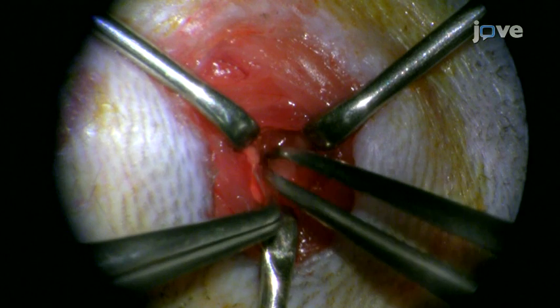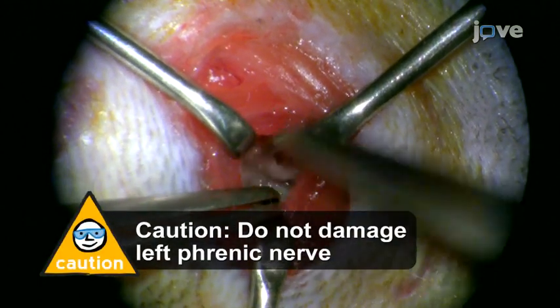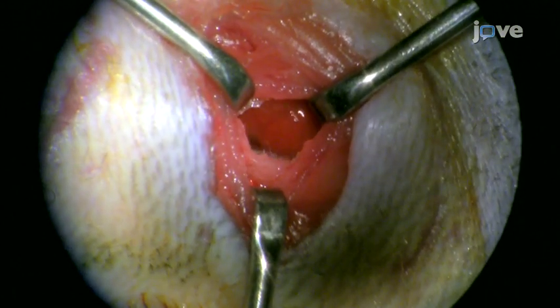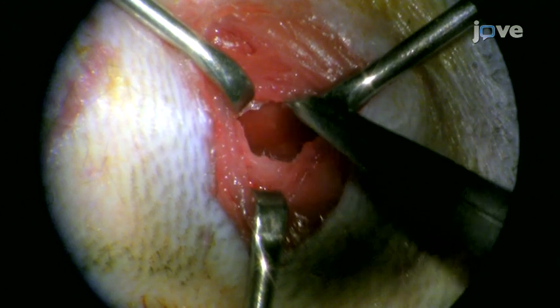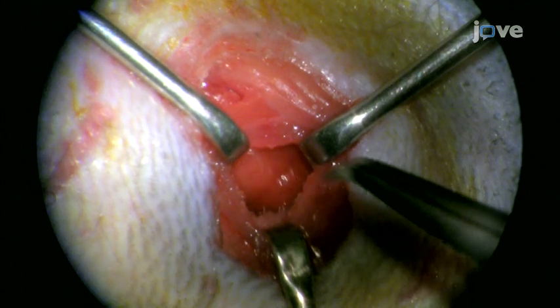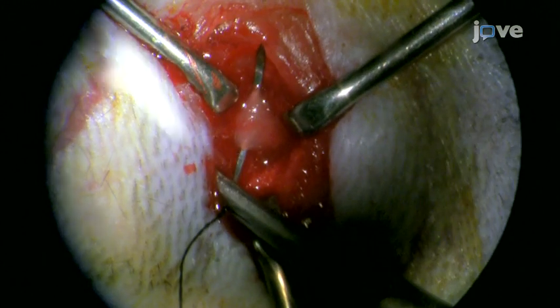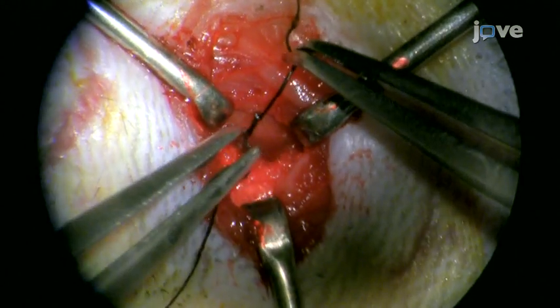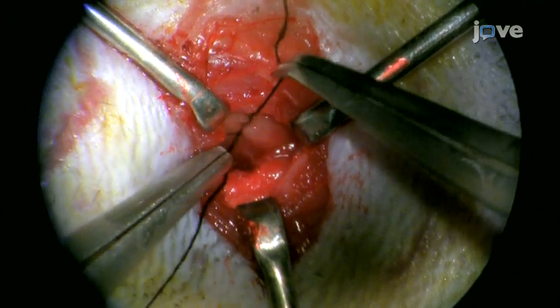Then using forceps, rupture the pericardium and use a piece of wet gauze to push aside the lungs. Reposition the hooks to the inside of the thorax so that a large part of the left ventricular free wall and part of the left atrium are visible. Then, using the atrium to locate the left coronary artery, insert a 7-0 silk surgical suture under the left coronary artery and knot the suture 2 mm below the edge of the left atrium to standardize the infarct size.